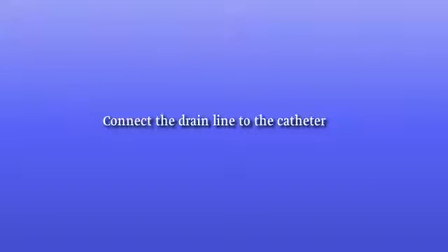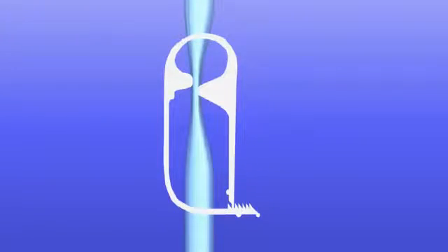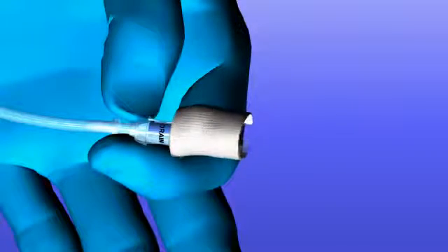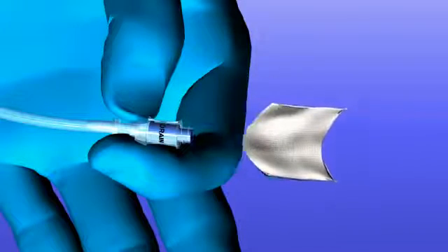Connect the drain line to the catheter. Squeeze the pinch clamp on the drain line completely closed. Hold the catheter valve in one hand and vigorously clean the valve surface and around the valve with one of the alcohol pads.